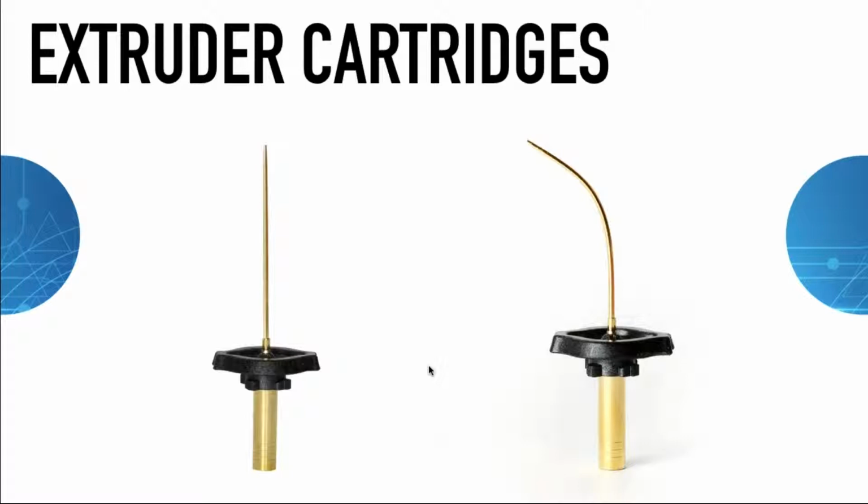And there's different gauges of needle sizes. There's a 20 gauge, a 23, and a 25. I use a 23 gauge needle, heavy body, 100% of the time. I just find that the tip size is wonderful. The tip size allows us to seal, I'd say, 100% of the root canals that we work on. And the viscosity of the gutta percha is such that when you start to extrude it, you actually feel yourself backing out of the canal.